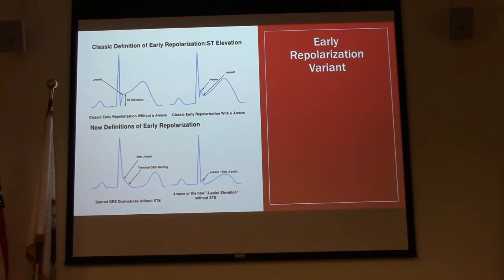It is very hard to see when you're taking a look at it. A lot of times you're going to need to enlarge it a little bit to make the determination if we have any early repolarization. But early repolarization is fairly harmless. Well, it is harmless, but it is a STEMI mimicker. People usually will say, oh, it's elevation, when it's truly not.